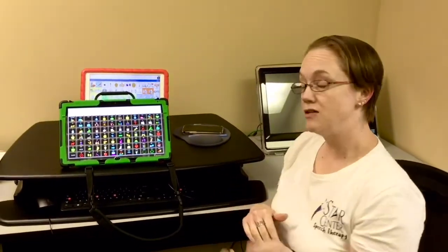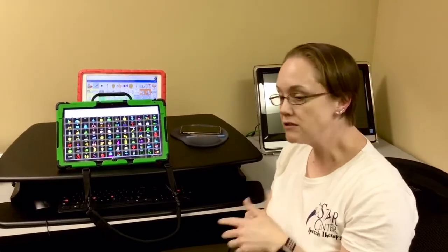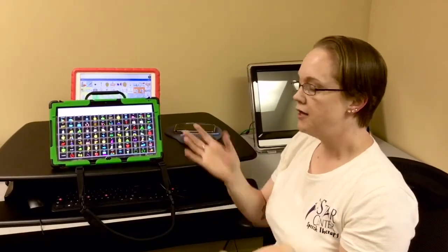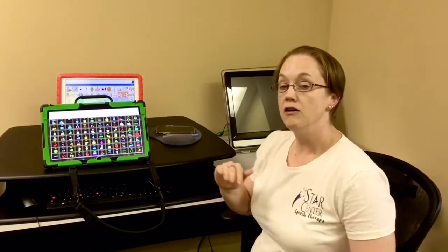For your clients that use switches, we have pedal switches that can be used with feet. All sorts of switches, round, big, small. They can be stuck to wheelchairs, normal chairs, headrests. We've got clients that can access communication from all sorts of methods.